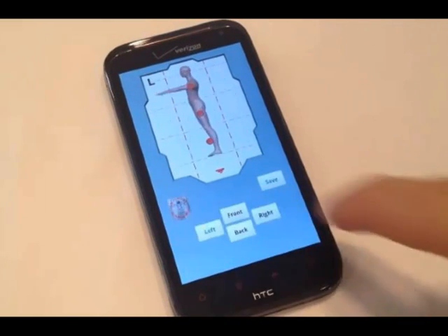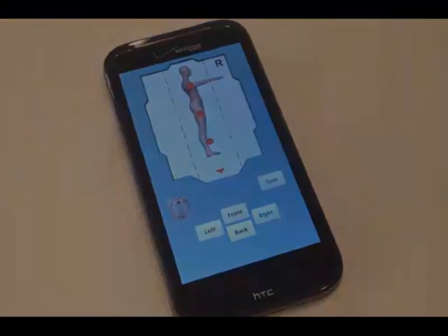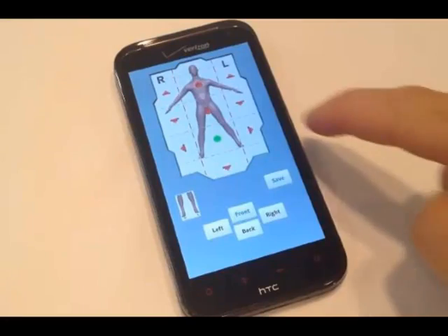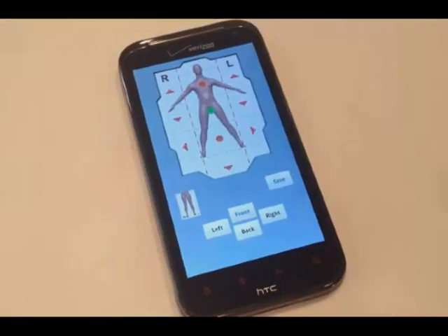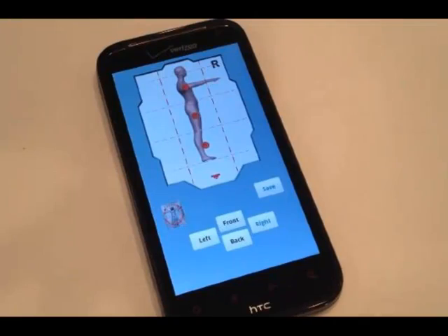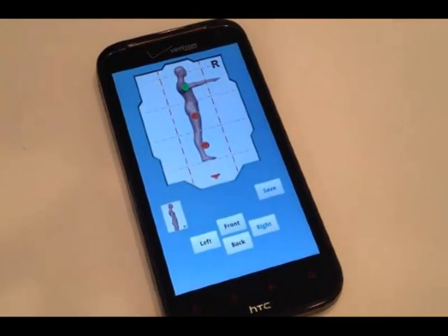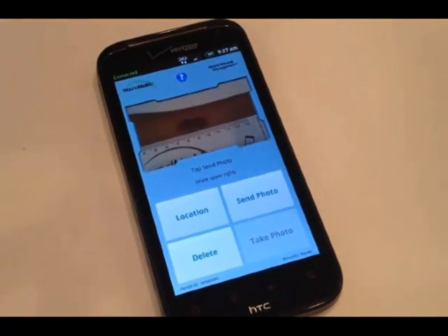Tap a direction to rotate the image to the appropriate location of your wound. Tap a button on the grid to mark the general location of your wound. For example, for the picture we just took, tap the right button, then tap the upper arm, then tap save. You return to the main screen and are now ready to upload your photo.